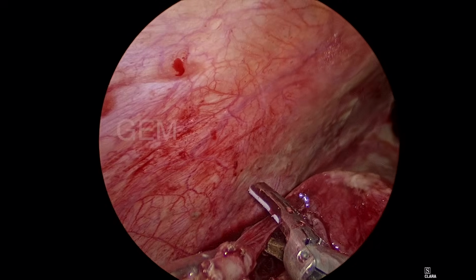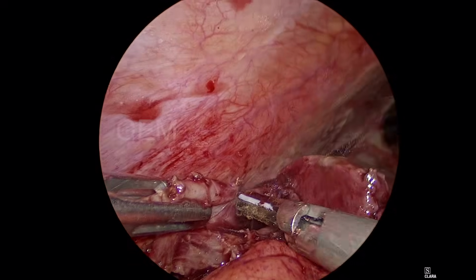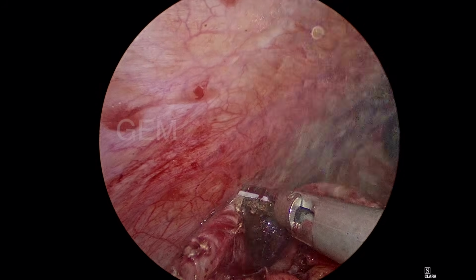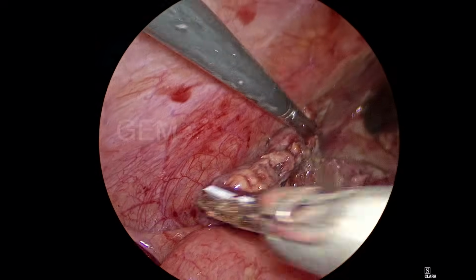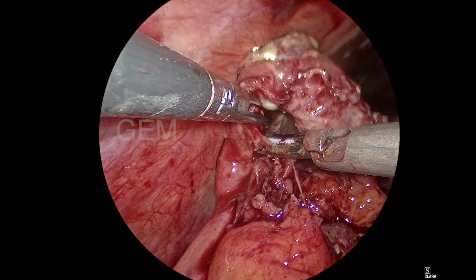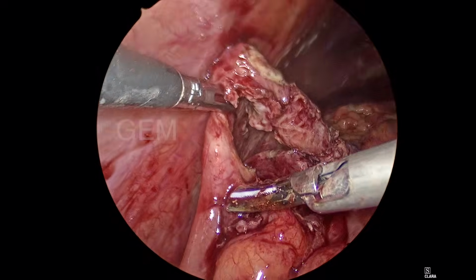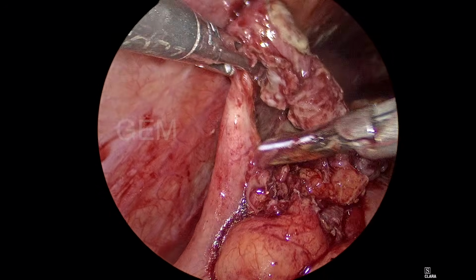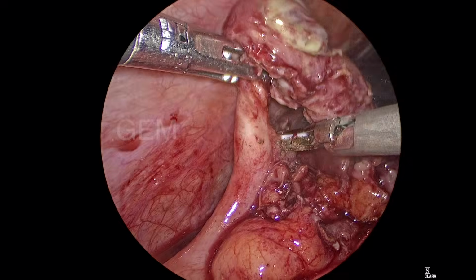Always go close to the appendix when your appendix is lying on the cecum. Always try to go close to the appendix. Again, I have to give a wash in that area before proceeding further. Now you can see it is a normal, not much damaged base of the appendix.